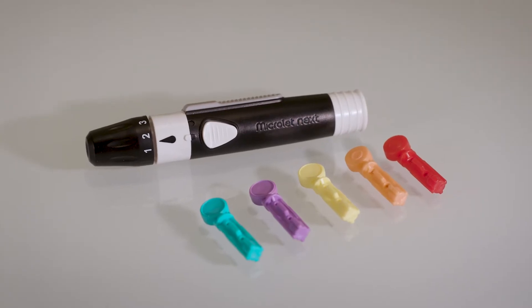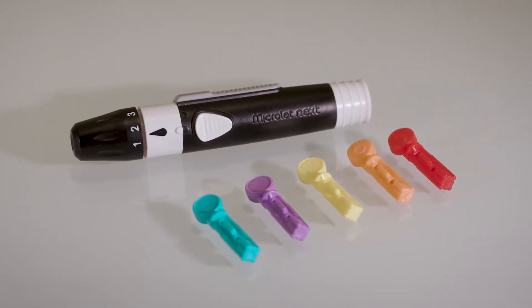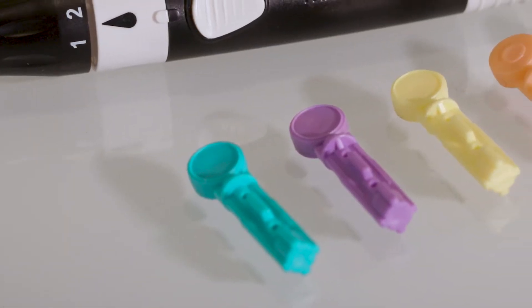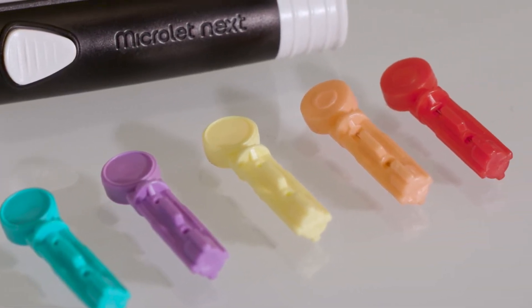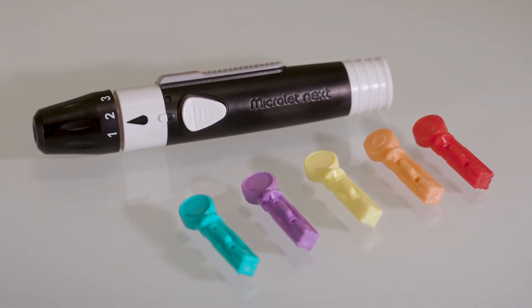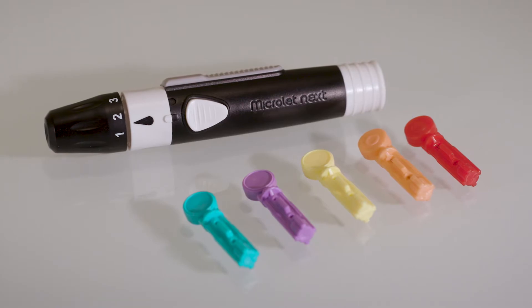We'll be using a Microlet Next lancing device and lancets. These lancets come in lots of colors, but they're all the same. If you're using a different type of lancing device, follow the instructions that came with it.